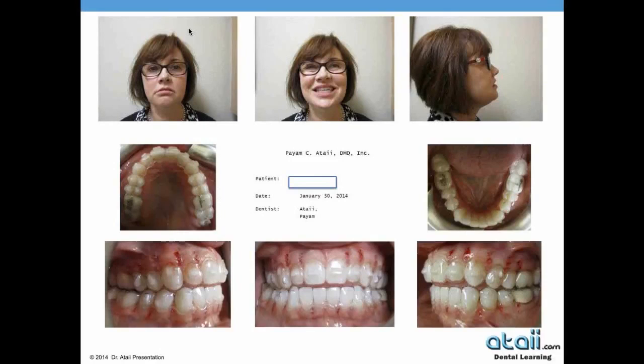So first visit, the patient gets attachments. First visit, whether you like to use topical or a local injection of infiltration, at that point you introduce the Propel. You see the patient back, if you like, in the next 4 or 6 weeks. They typically heal up in the 2 to 4 week time period.